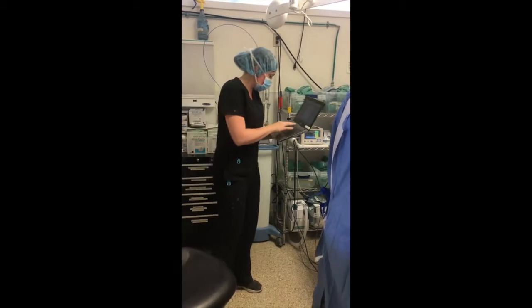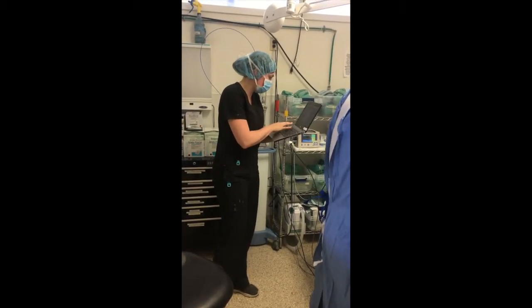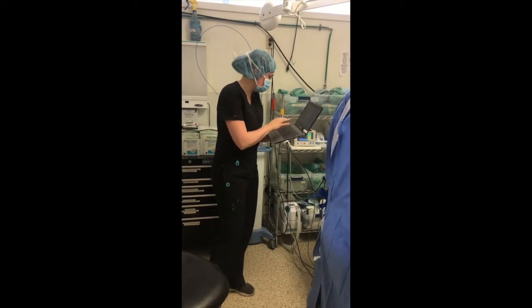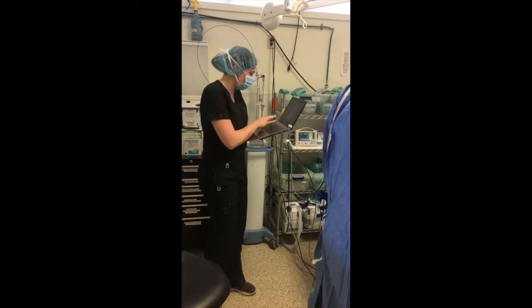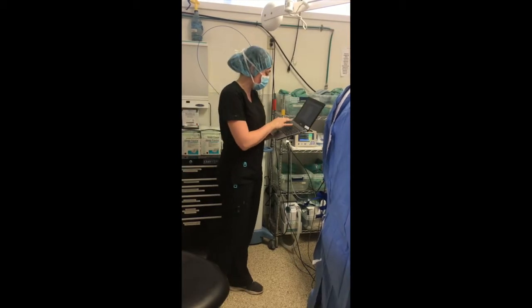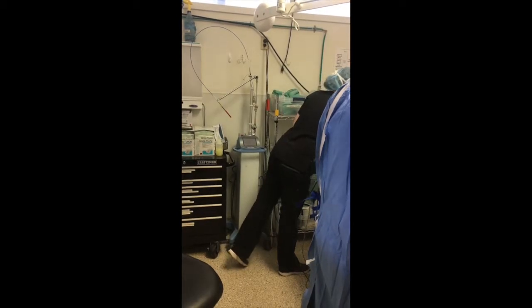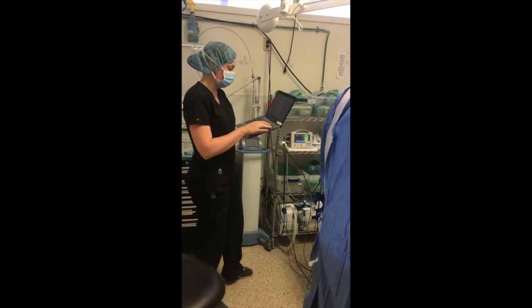I'm going to take her heart rate, her SpO2, her blood pressure, first the systolic, then the diastolic, and then the MAP. Then I'm going to put down her temperature. She is not on any IV fluid, so I'm going to write NA. Her gas level is 1.5. I'm actually going to turn that down to 1 for her. Now she's on 1% ISO.